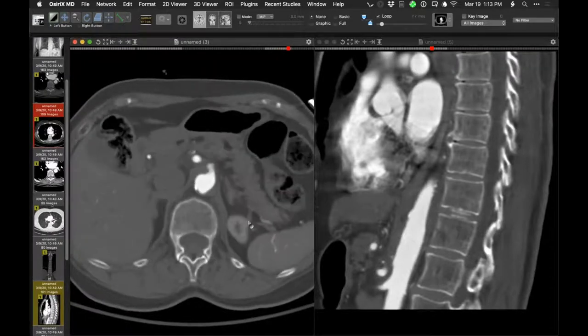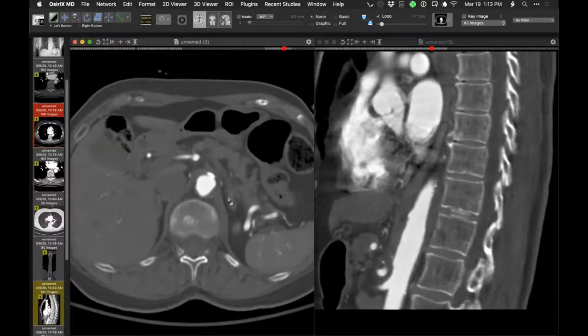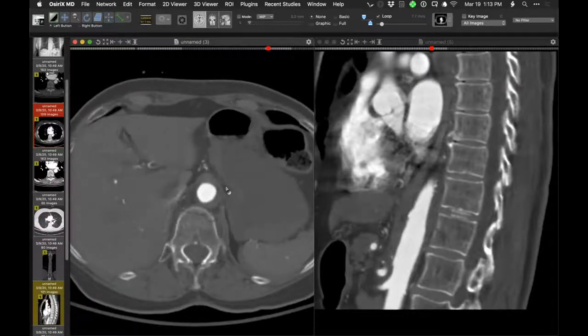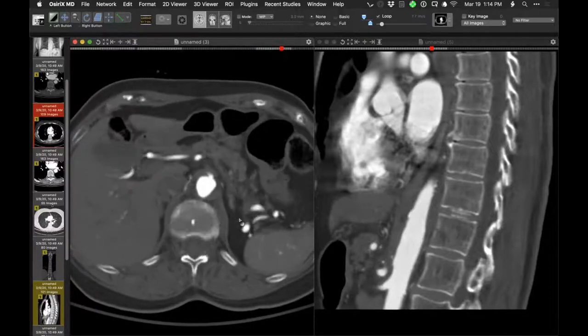It was just managed by observation only, but it gets hard when there's atheromatous calcification, and perhaps hard to separate out intraluminal thrombus from a true intramural pathologic process. But I think the appearance particularly here is suggestive of perhaps an intramural hematoma. I don't have a non-contrast image to look at, but what do you think? It didn't really affect management, and the patient really had a bad head injury anyway. But I do wonder whether it is, at least in part, an acute intramural hematoma.